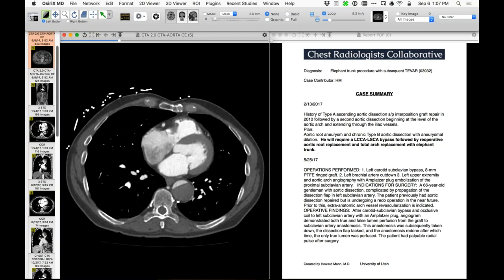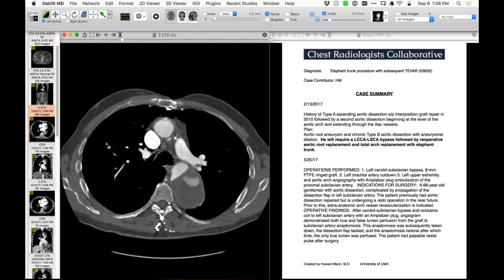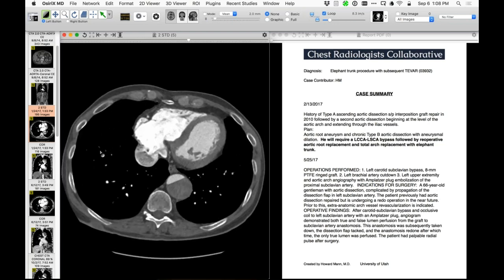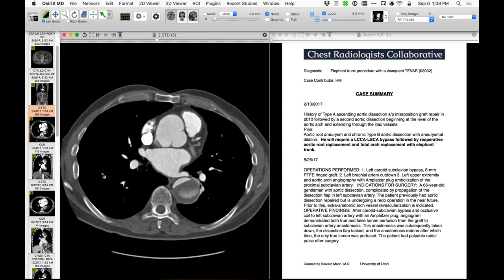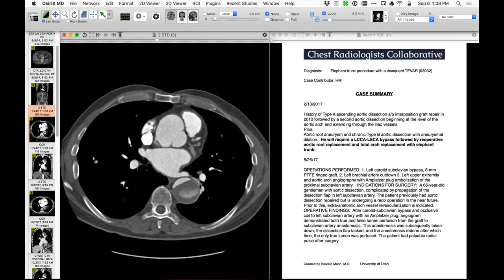Going back to 9/14 on the left-hand side, there's a history of surgically managed aortic dissection. There is an interposition graft in the ascending aorta, and you can see there is still a false lumen that contains some contrast-opacified blood. Moving forward to January 2017, you see the same findings: a large false lumen with passage of contrast-opacified blood, but also quite substantial dilatation of the aortic root.